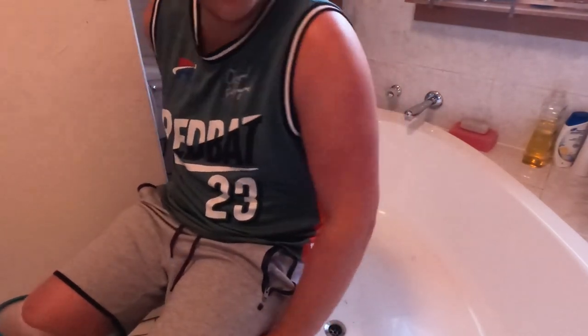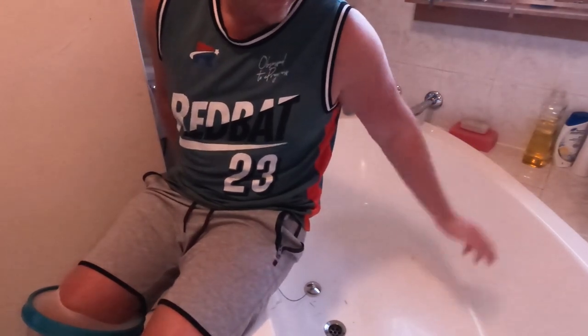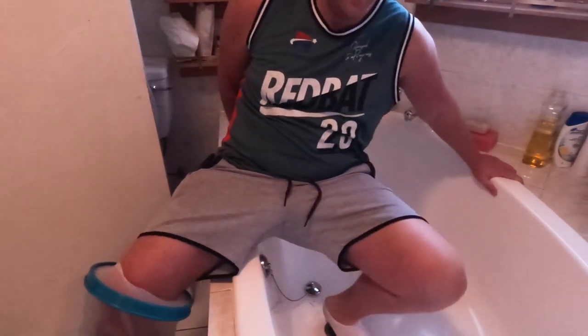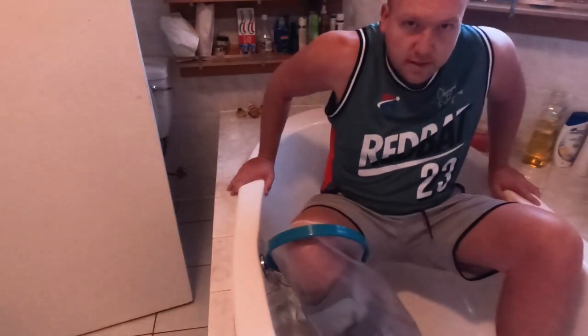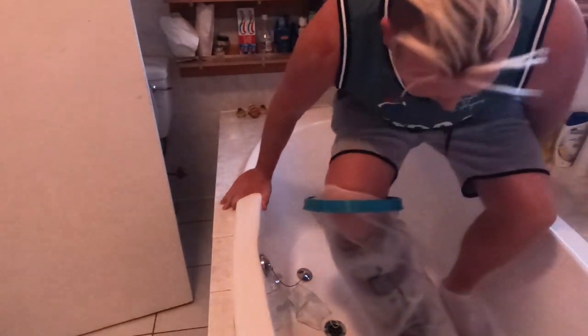To get into the bath you need to be a bit of a gymnast, but this is the safest way I've found without slipping. I have an oval bath that's quite wide — a smaller bath might be easier. I lean on the edge, step in with my good foot, then bring my bad foot in. I used to sit on the side and just sponge bath and rinse off, but now I'm able to get right in and keep the boot in since it's waterproof.